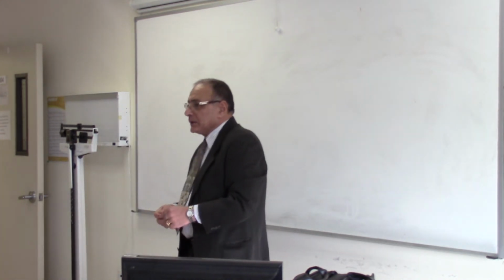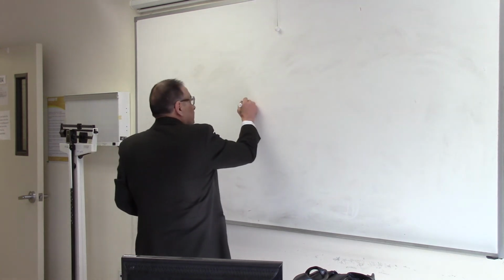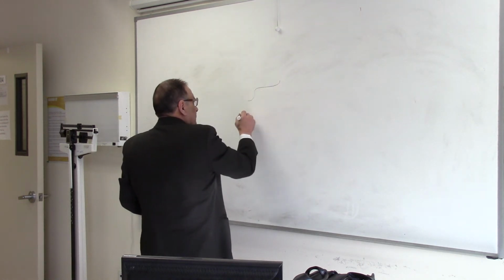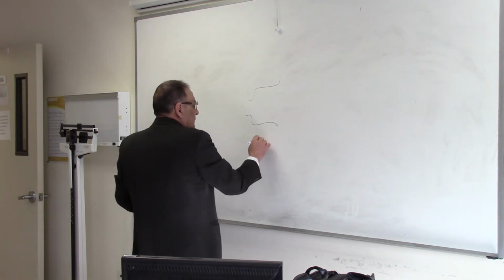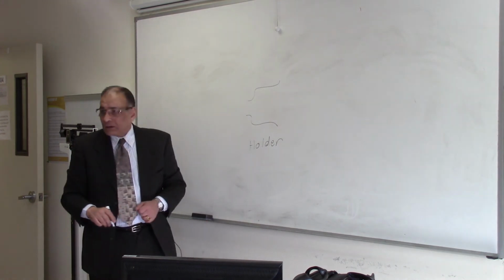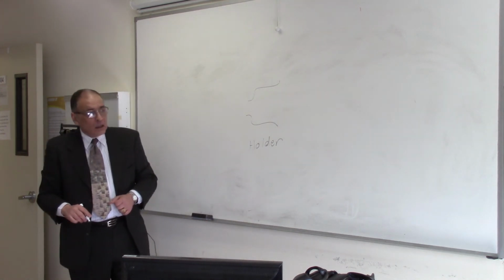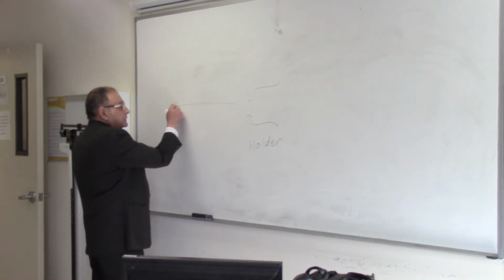To draw blood here, we use what's called the holder. And also the needle. The needle here is different.